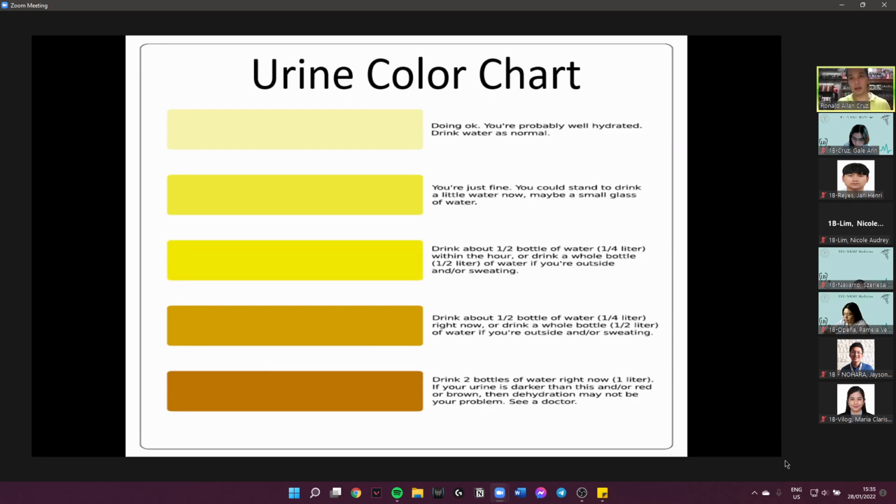If the urinalysis results might not be congruent, like for example, you have a dark urine specimen, a dark yellow urine specimen, but the specific gravity is around 1.01. So that's dilute. So that's incongruent. No, that's incongruent. Typically, a dark urine would have a high specific gravity because high amounts of solute. You might want to ask the patient, are you taking any medications, multivitamins, things like that. No? So there.